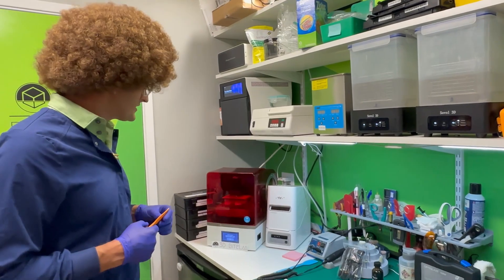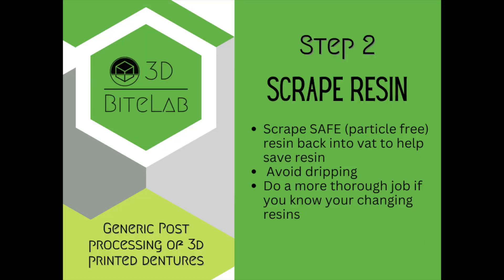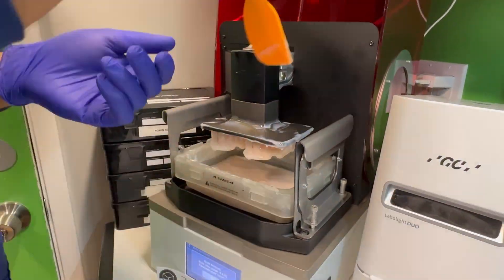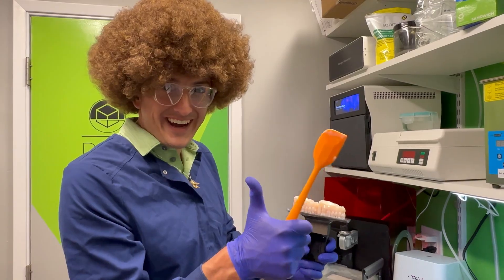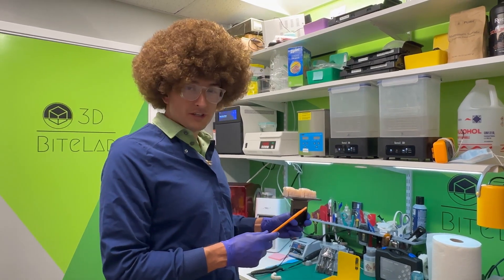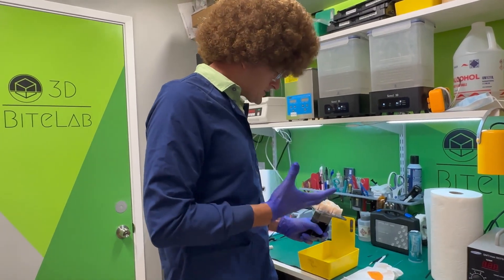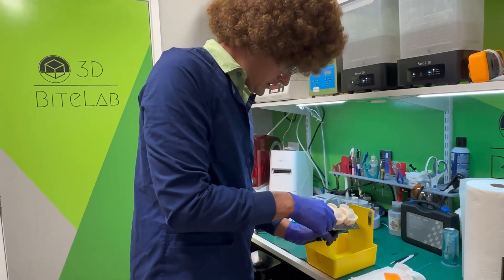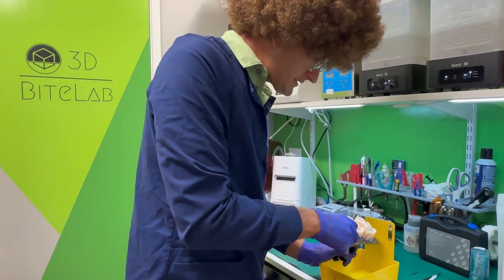Now we've 3D printed our dentures with Rodin's sculpture, so we're going to go ahead and remove these dentures from the build plate. Now one of the most important things is, once you begin this process, you want to make sure none of the solid particles left can end up back in your printer. If you're using a razor scraper, make sure you go against your device and just move it back and forth.